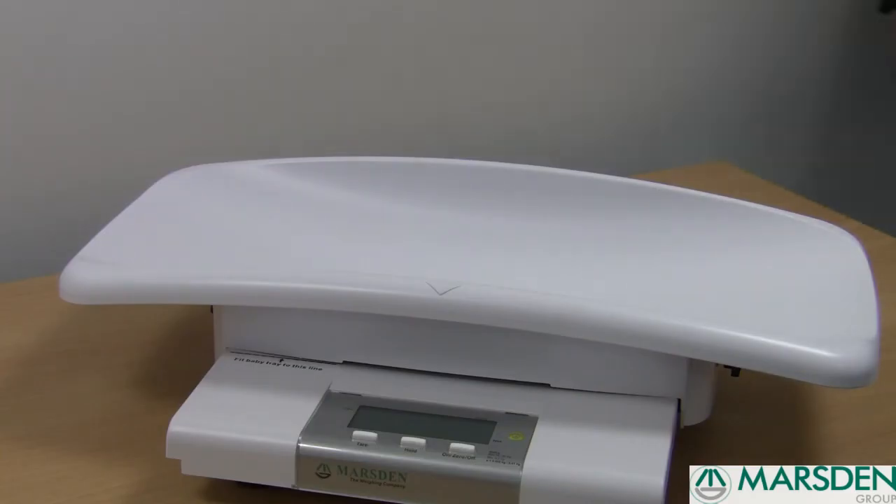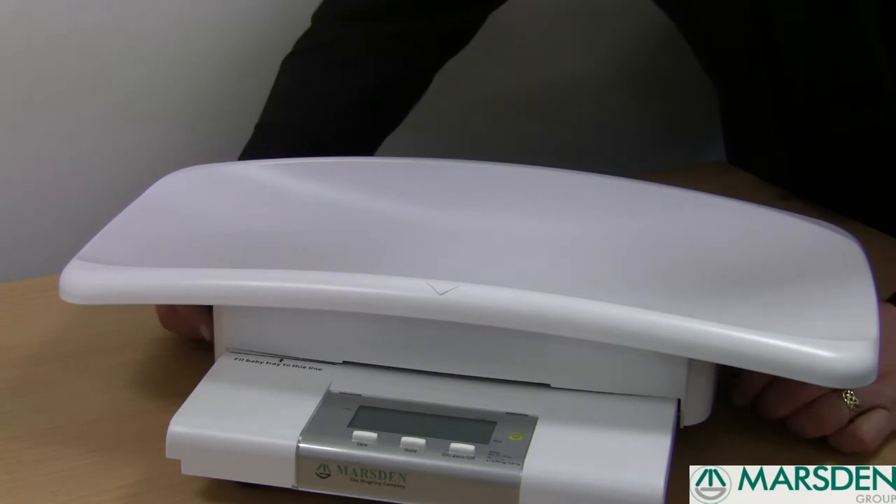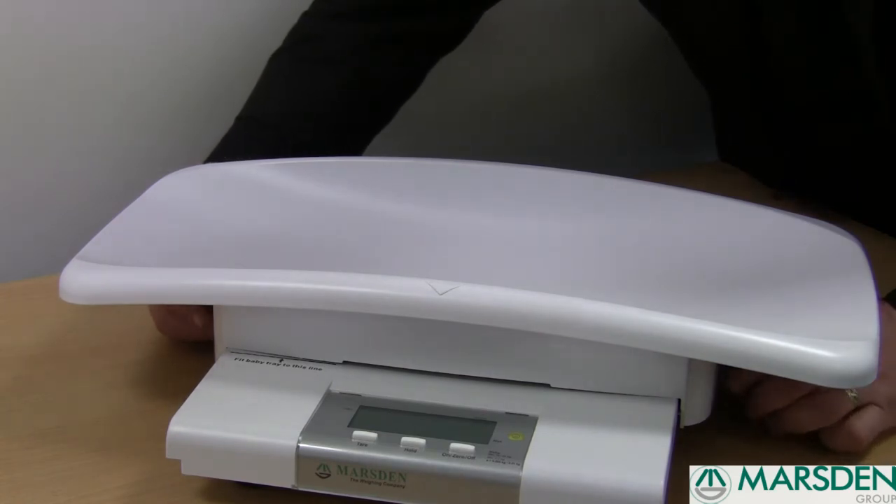With this scale, you're also able to remove the scoop by undoing the nuts on each side. Take the scoop off and this allows you to then weigh toddlers who would like to stand on the scale.